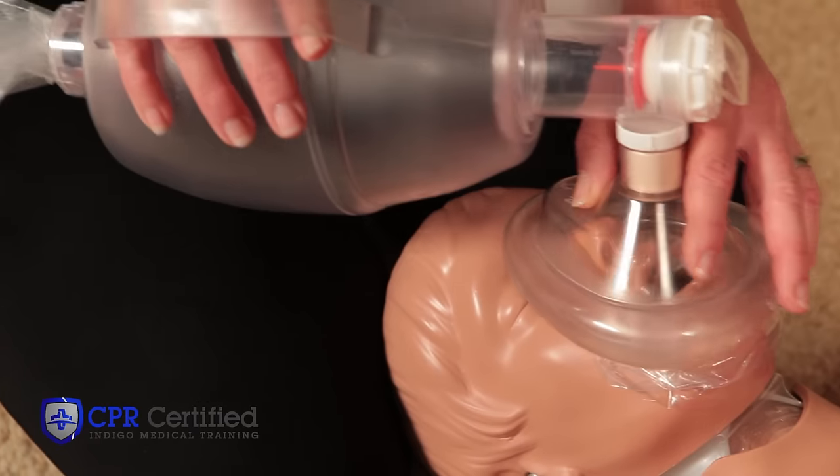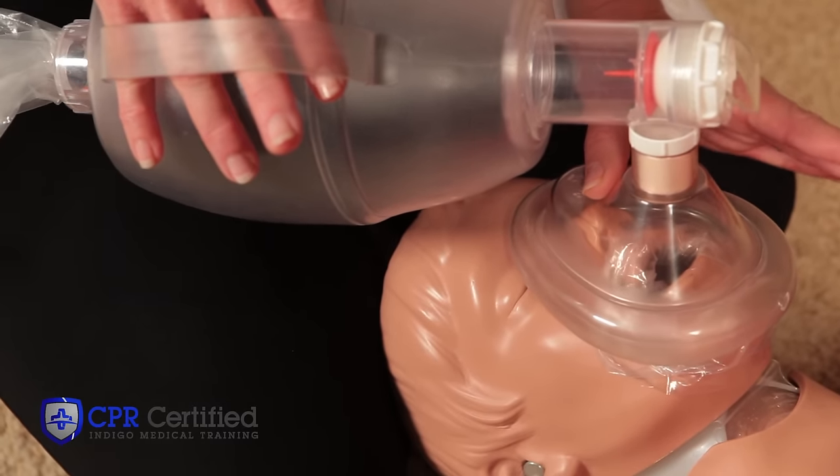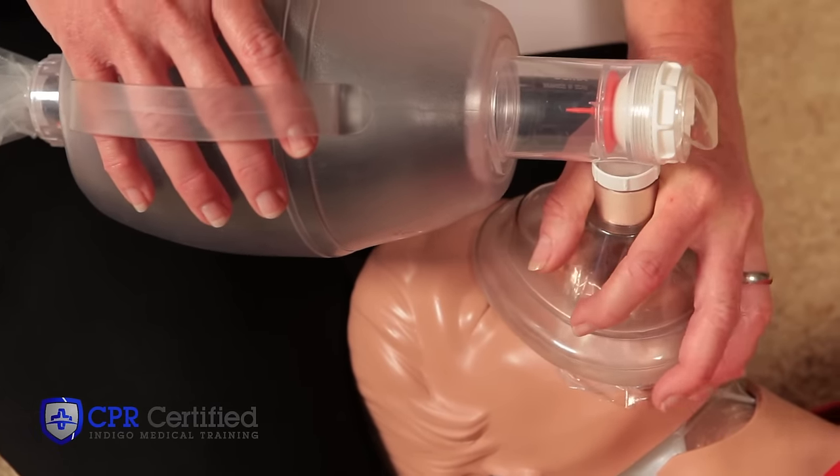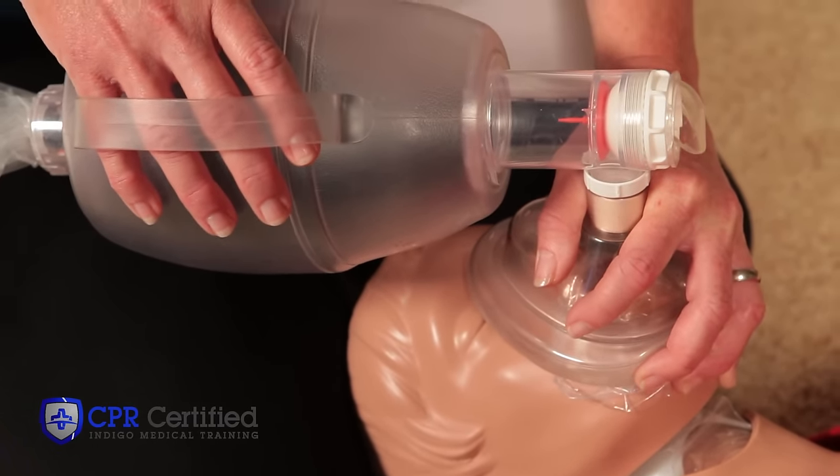Place the pointed end over the victim's nose and the rounded end over the chin. Hold the mouthpiece stem with your thumb and first finger. Hold the mask and the victim's chin with your other three fingers.